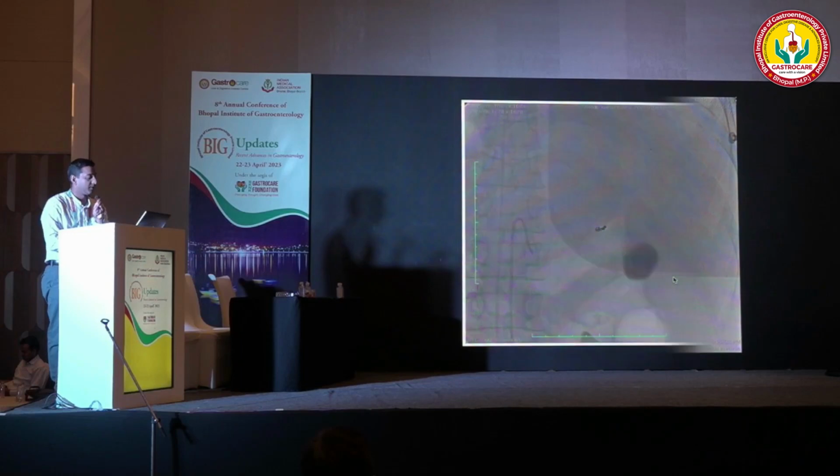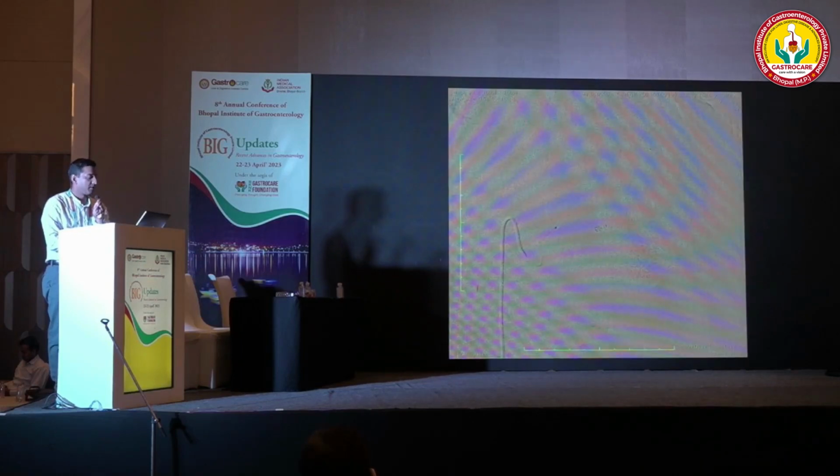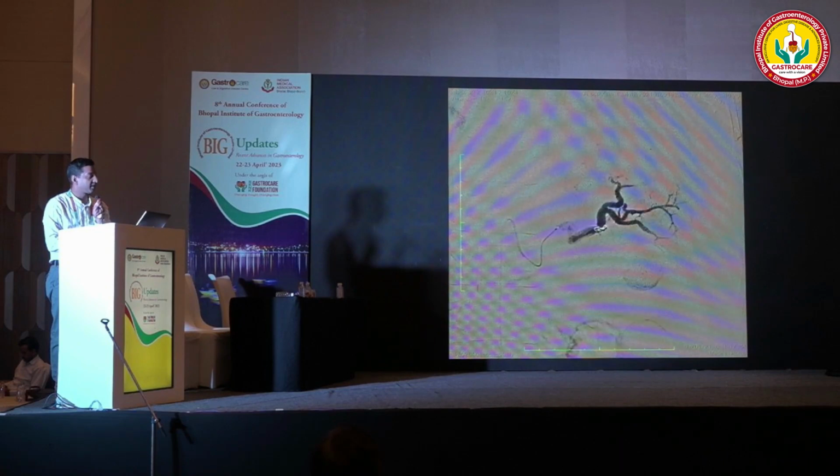And this is the final picture of the post-embolization. There is complete exclusion of the aneurysm from the circulation.